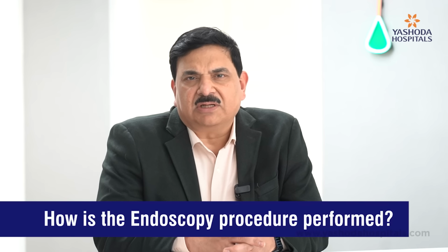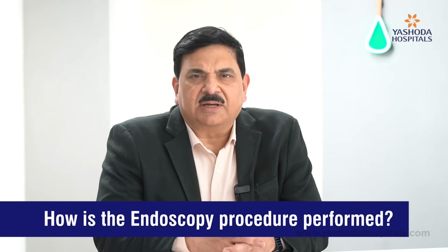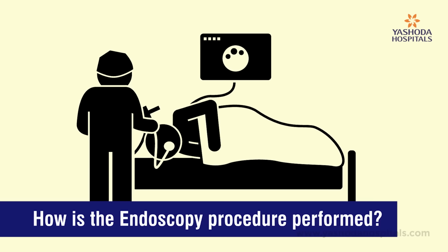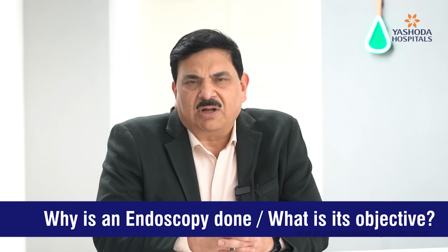So what is the procedure? Procedure is inserting an endoscope into the mouth of the patient, which traverses through the esophagus, goes into the stomach, visualizes the stomach, then into the upper part of the duodenum. Basically all this is done to see the mucosa and any lesions that are present in the stomach and esophagus and also the duodenum.